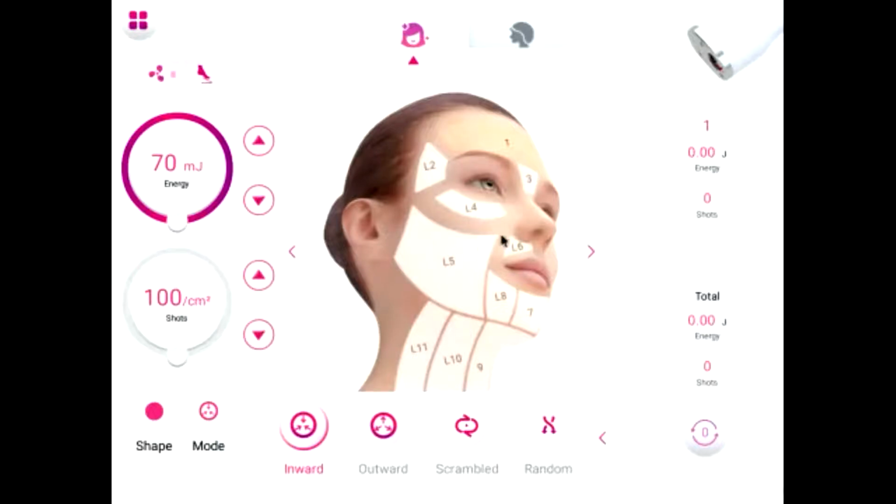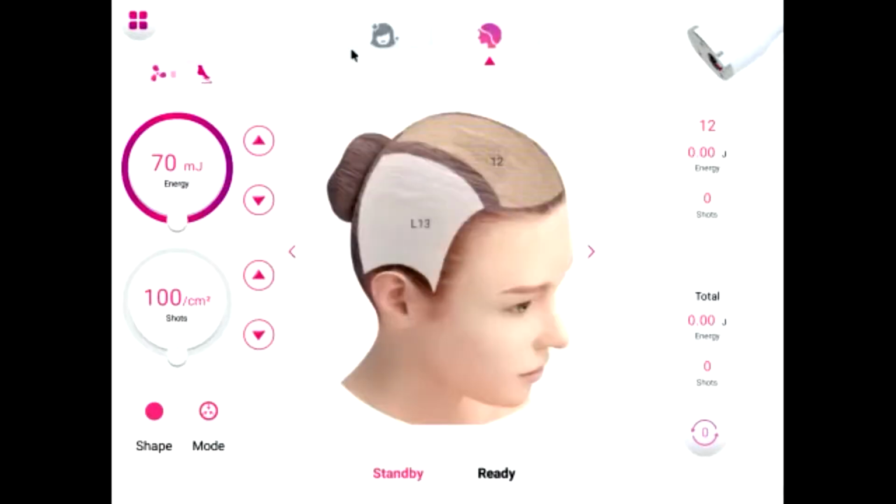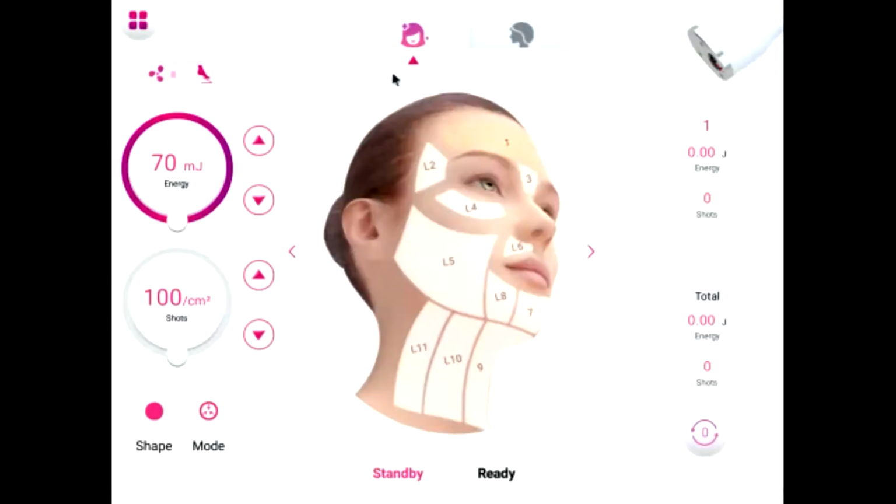The middle side is the operation part for the face or the scope. The grid reminds the user of the operation procedure. There are 3 stages for each part. The green marks mean no action. Yellow marks mean selected to be treated. And the orange means it has been treated.